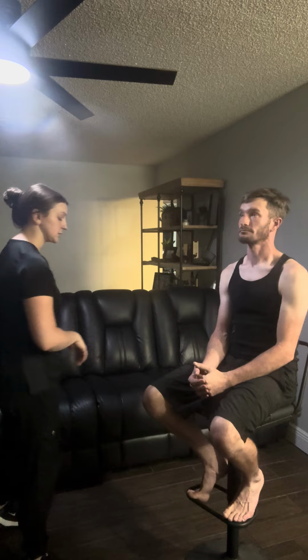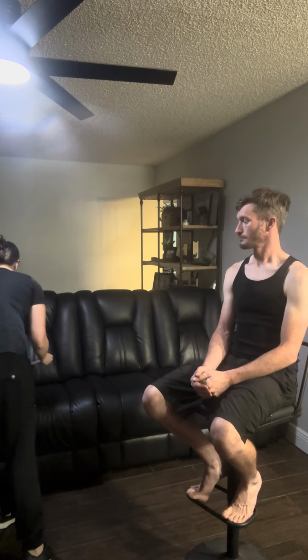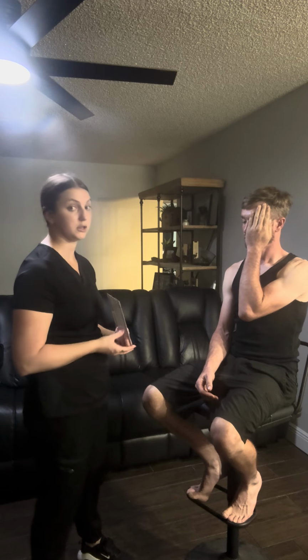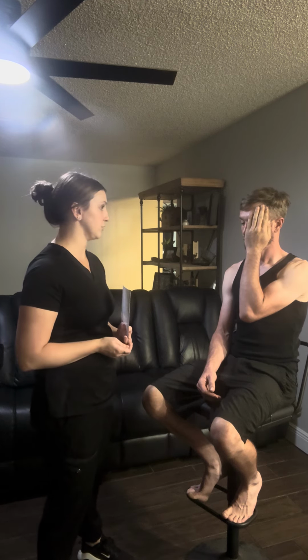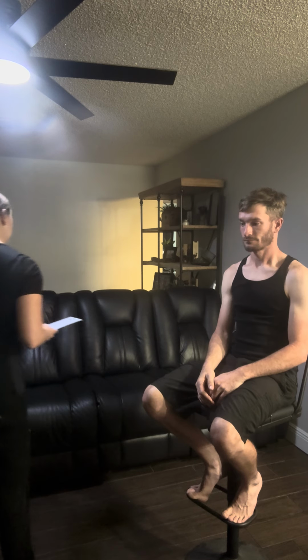We are going to go back to the eyes and do the visual acuity test with the Snellen chart. Okay, so covering your left eye, I want you to read the lowest line that you can see. L, T, F, F, H. Good, now cover the other eye, same thing. L, T, F, F, H. Perfect. So visual acuity is 20/20 on each eye.